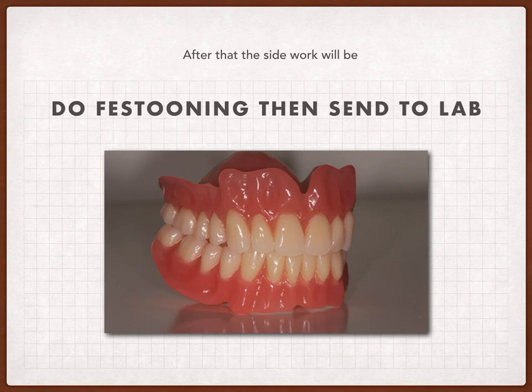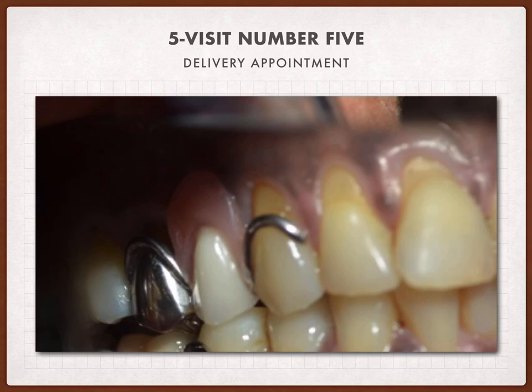He will cook the denture if it is a hot cured acrylic denture, and after that he will send it back to us completed, and then we will deliver it to the patient, check the occlusion if it is good by the articulating paper, and check the fitting of the denture if it is good by PIP or pressure indicating paste, and then we will correct accordingly, and then we will instruct the patient that he should clean his denture during the day and put it in water and salt at night or water only at night.